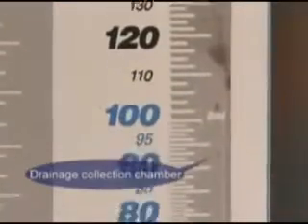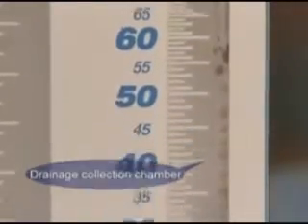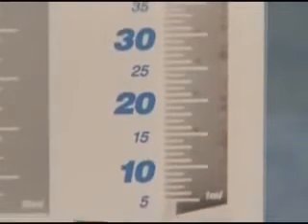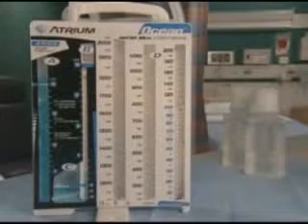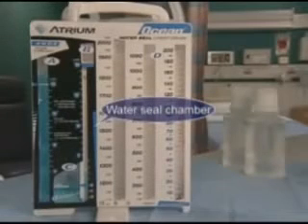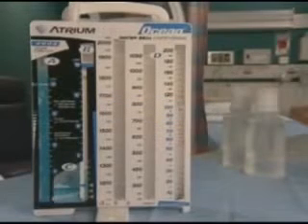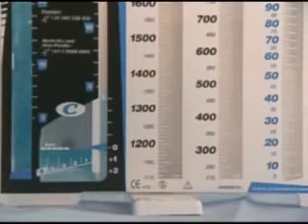The drainage collection chamber collects and measures blood or other fluid that drains from the pleural or mediastinal space. It usually has at least 2 compartments to capture large amounts of drainage. The water seal chamber has a one-way valve to create negative pressure that lets air and fluid escape from the pleural space and prevents air from being pulled into the pleural space. The water level in this chamber reflects conditions in that area.